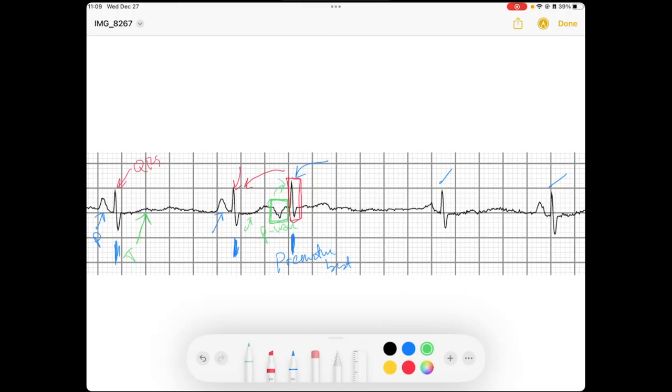And so, because I see a P wave that is, in this case, this downward deflecting P wave, the morphology of that P wave is much different than the previous P wave, which is the normal P wave, which is an upright P wave. So, I know because of that, that is an ectopic P wave. So, because of that, the cause of the premature QRS complex was a premature atrial contraction that led to ventricular depolarization in the normal fashion.